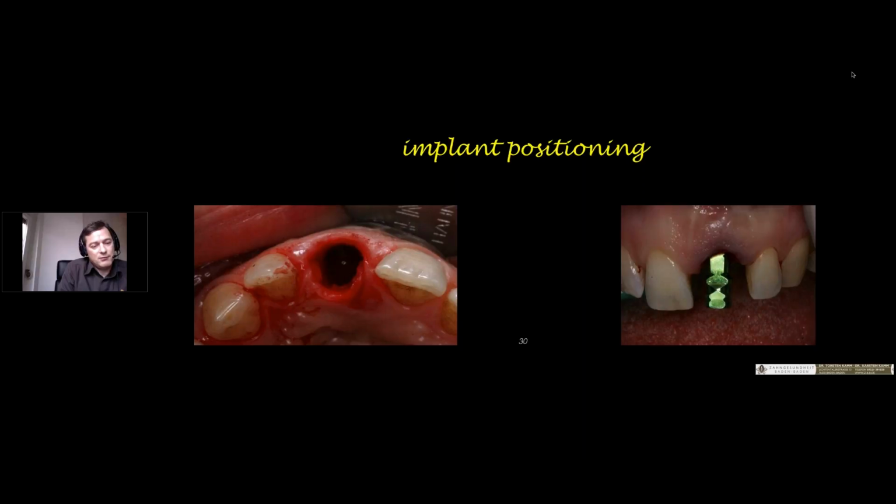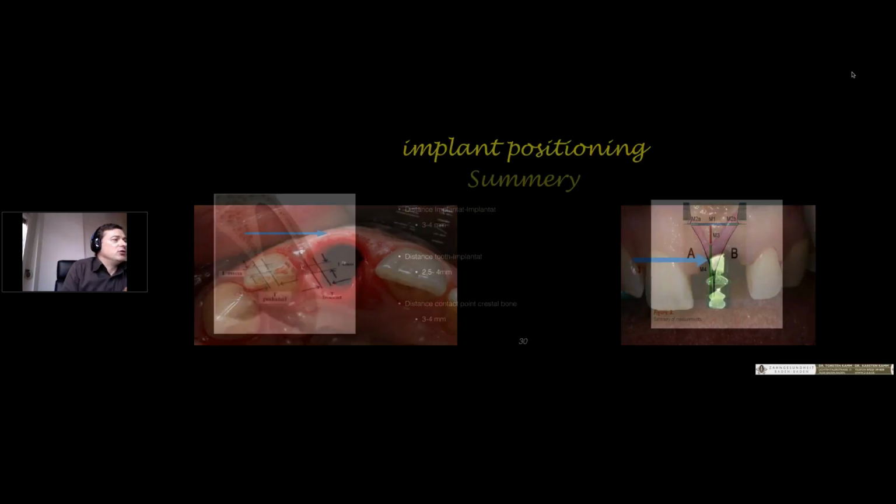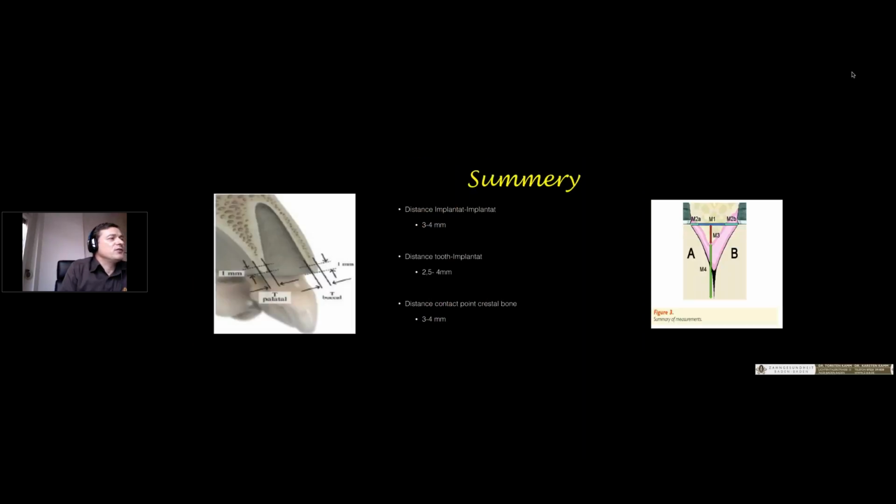This is very important. This kind of implant, immediate implantation, immediate loading, is not very easy. All these cases are expert cases, not beginner cases. It's very important because if you get the wrong position, wrong angle, you're losing soft and hard tissue. So that is very important.